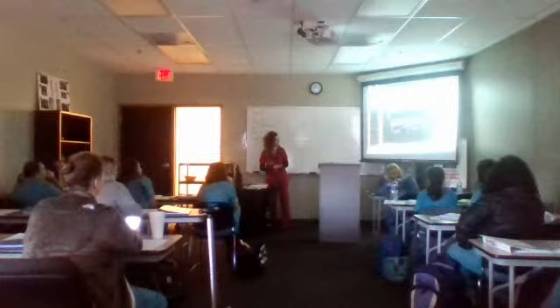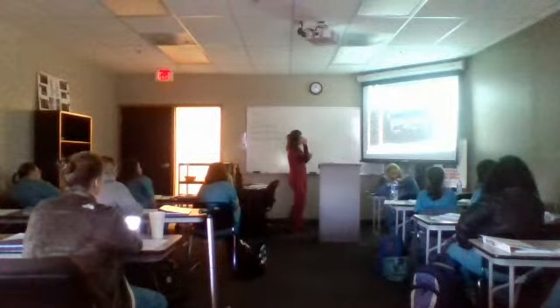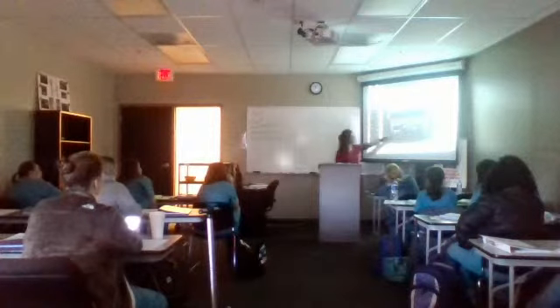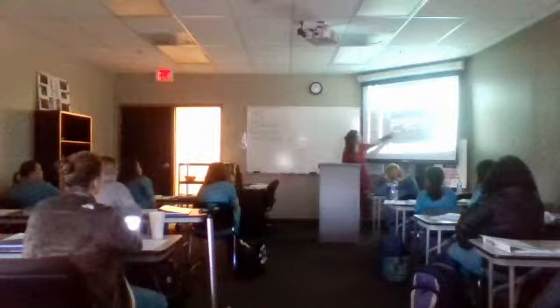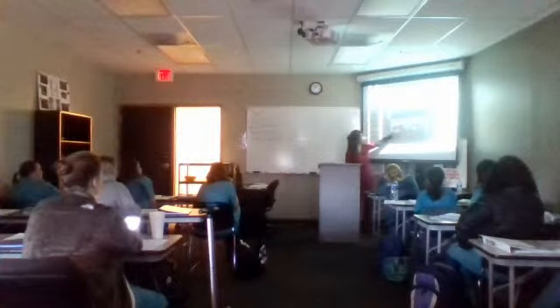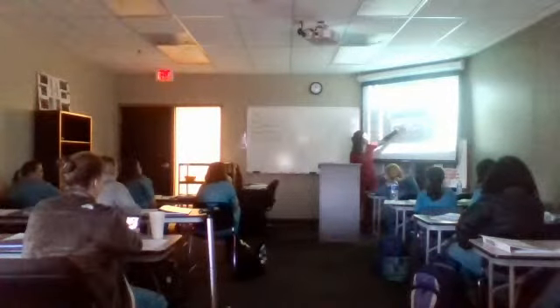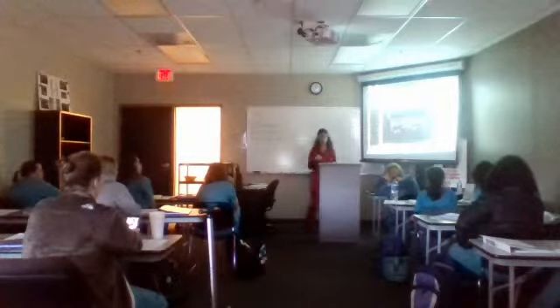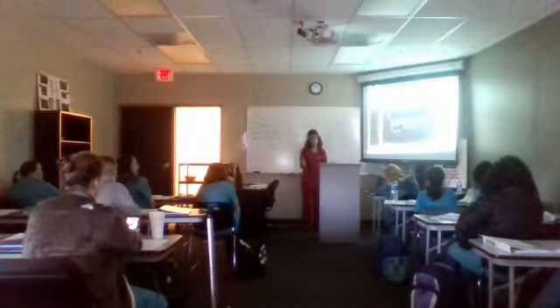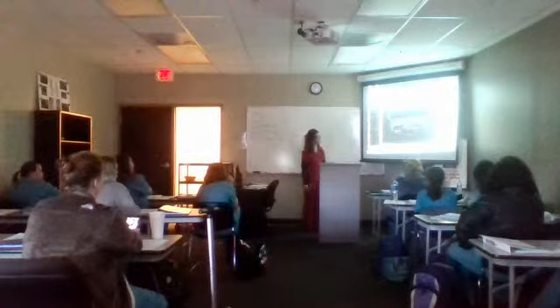All right. So this is a picture of transverse of the vein. If you have your common femoral vein, you've got to have what? Common femoral artery. And what enters the deep system at the common femoral vein? The greater saphenous vein. So here it is entering the deep system. Now, some people, and hopefully I'll find one, have really big greater saphenous veins, a little bit easier to see, okay? So your artery and your vein, same name, there's greater saphenous.